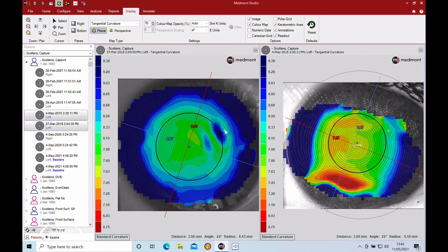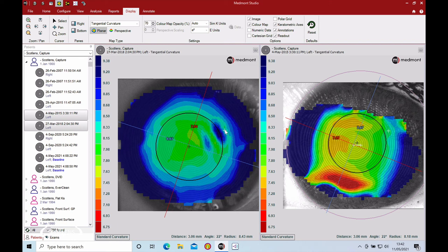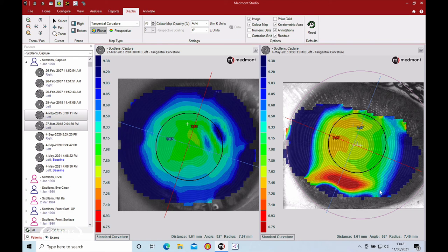In this case, it's a dry eye, but it may be a corneal scar or an irregularity in the cornea. So if you've got multiple captures for that eye, you would know it's just an irregularity of the one map. On this image on the right-hand side, you can see we've got a tear film meniscus at the bottom, which could look quite sinister to your patient, but it's just a bit of dryness, a bit of mucus that's been caught.